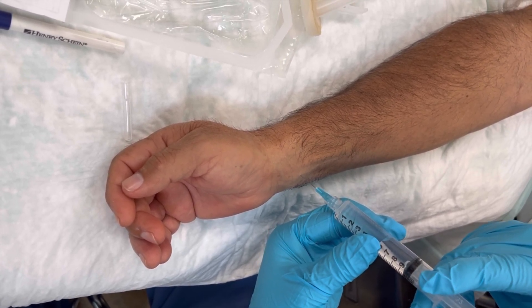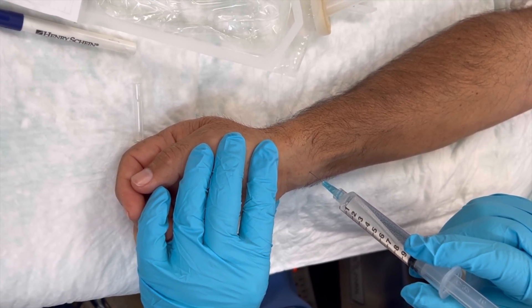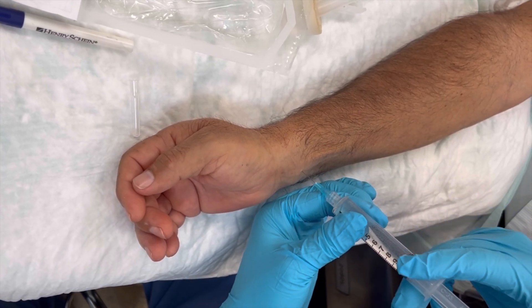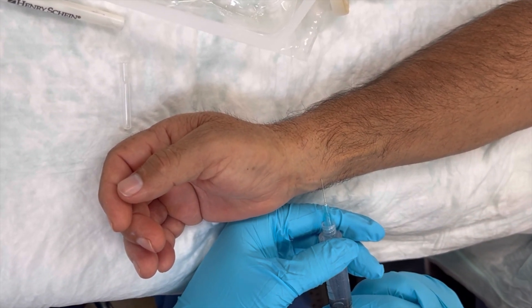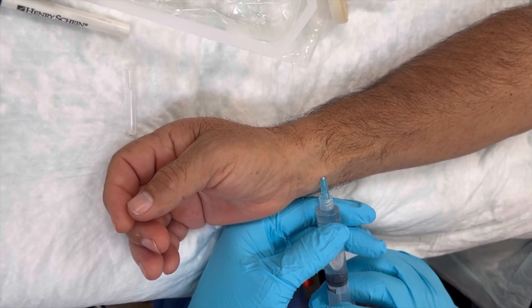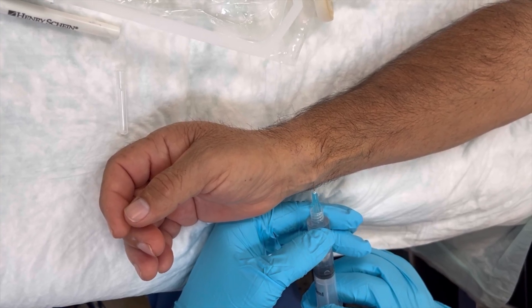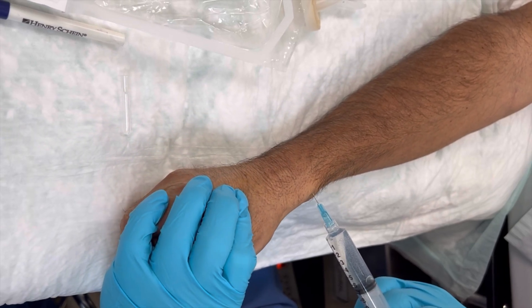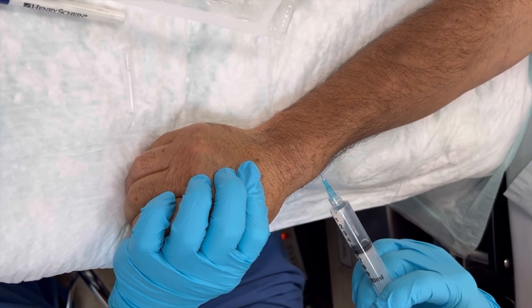If you don't feel the pop, you can advance until you touch the bone, then pull back about a couple of millimeters and inject. Then withdraw the needle and redirect the needle to the lateral side and start injecting, also withdrawing the needle. Then inject the dorsal part and toward the midline.